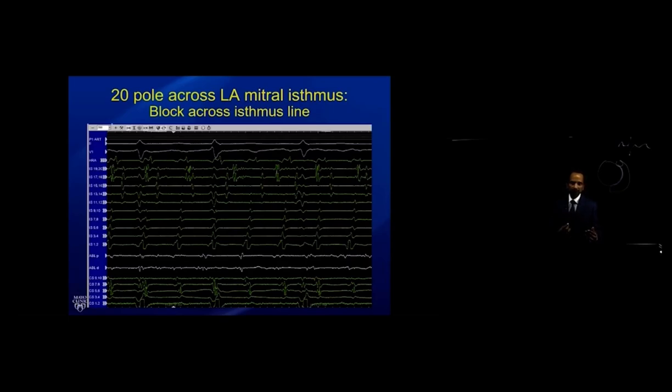In an extreme case, you could have had the surgeon using a cryopen or an incision endocardially that gives you a nice block, but didn't do anything in the coronary sinus. So this is an important, unique feature of post-maze flutter.